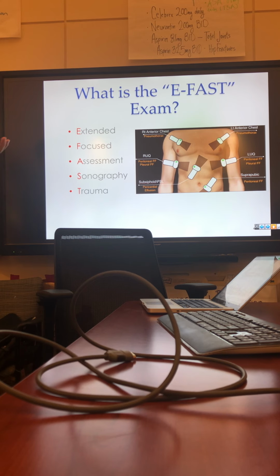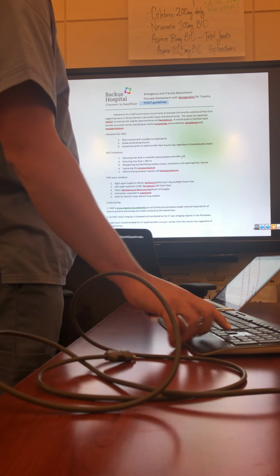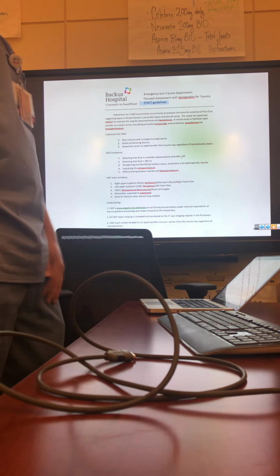Part of that is their guideline, as I'm sure you know, but it's always in hindsight. From what I'm told, over the last 10 years we've had cases where people have decompensated in CAT scan or shortly after CAT scan and were trying to be resuscitated in CAT scan, or they had to be rushed back to be resuscitated, and it was kind of like, can we prevent that from happening? And maybe we should be doing a FAST before the CAT scan. That's sort of historically, but mostly it's because we're told by our accreditation body that we have to do it. But I agree. I fully understand that there's a lot of problems with it, and I'm going to talk about a lot of these problems too.